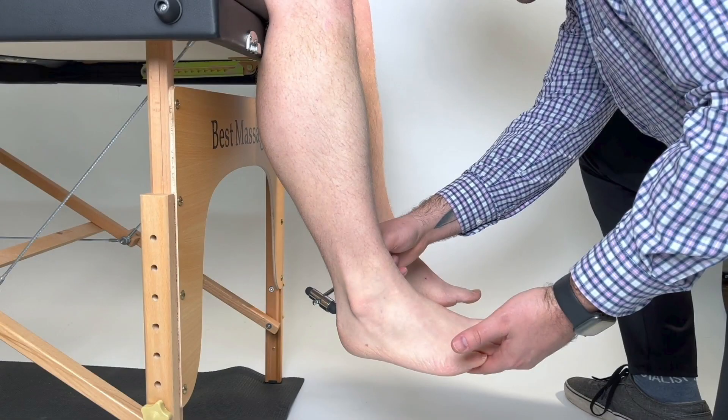Lastly, for the Achilles tendon, you may have the patient in slight dorsiflexion to help stretch the tendon before striking it.